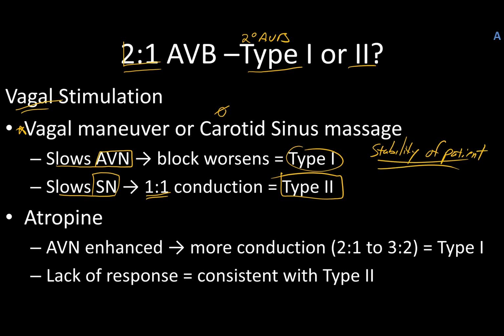Is the number one concern. If they're unstable, don't worry about this stuff. It doesn't matter. But if they're stable enough and really want to dig down, or if a cardiologist comes in and does this, now you know exactly what they were trying to accomplish.